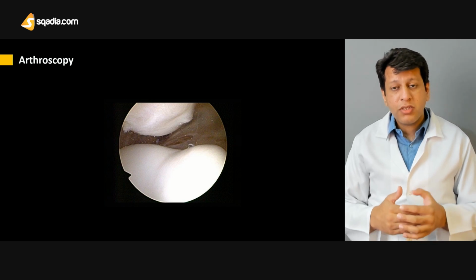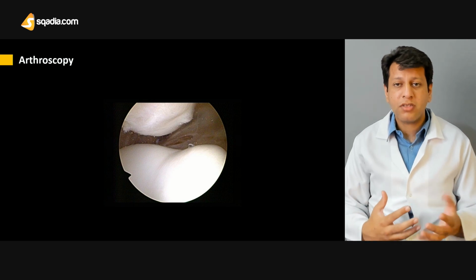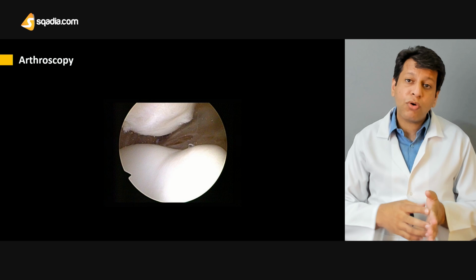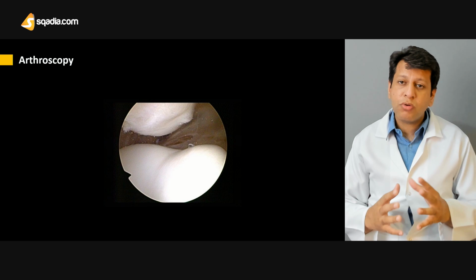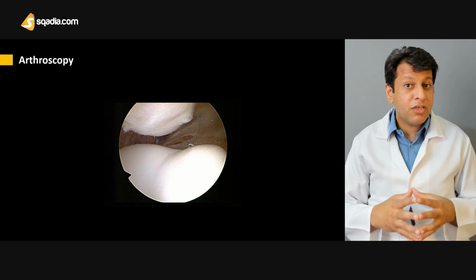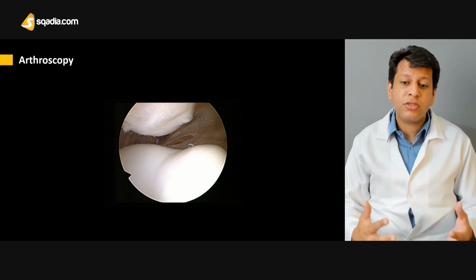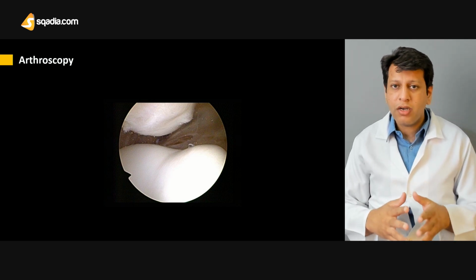Now a grade 4 injury practically means that the subchondral bone is exposed and the patient will eventually develop arthritis later on. Sometimes CT is also required, because when we are looking at the cause of patellofemoral pain syndrome, this could be underlying malalignment, or this could be patellofemoral instability. So we may have to go for CT to calculate the TT-TG ratio as well. Therefore, first we go for X-rays, then for CT or MRI, and then we may have to confirm our findings on arthroscopy.